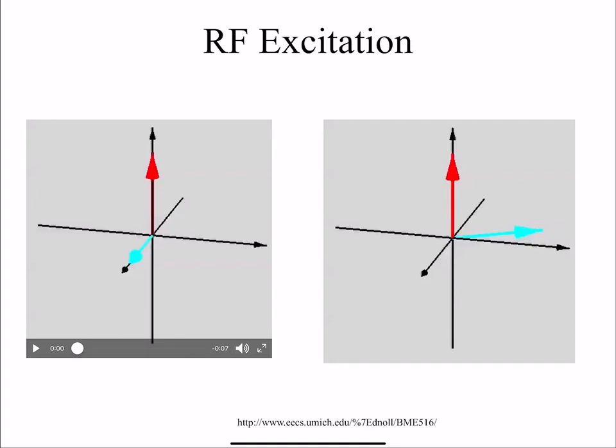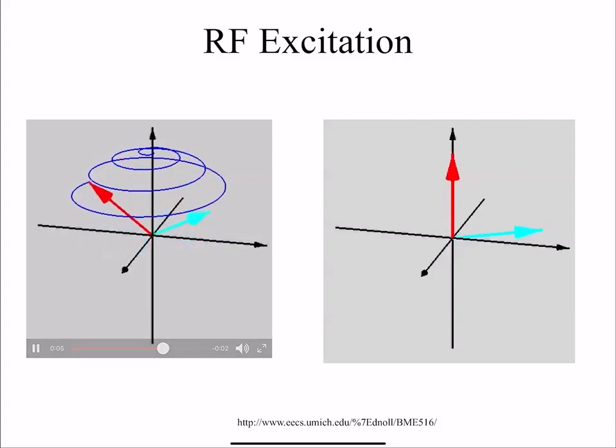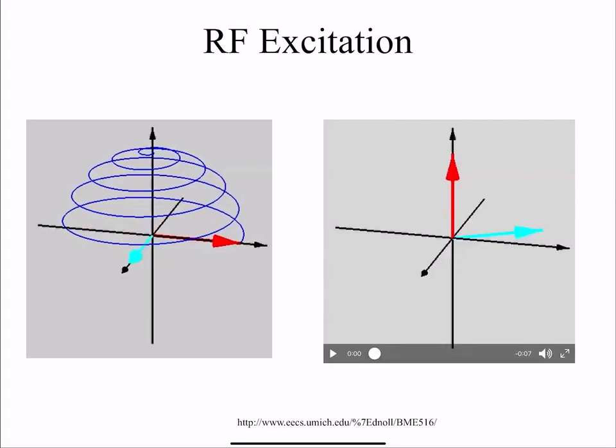So that's exactly what's shown in this picture here. So if you notice, this field is going around at the same rate as the precession. And so we can gradually get this magnetization to go down to the plane. In this example, tell me if you can see what's going on with this example. What's happening there? So we're not very effective at getting the magnetization away from its equilibrium point, right? So what's wrong with that cyan arrow? Yeah, it seems like it's going too fast, right? It's as if you're running around the merry-go-round too fast. Your friend's not going to come off, okay?